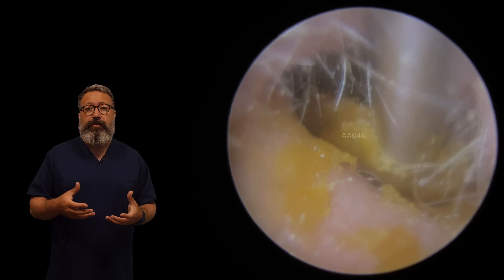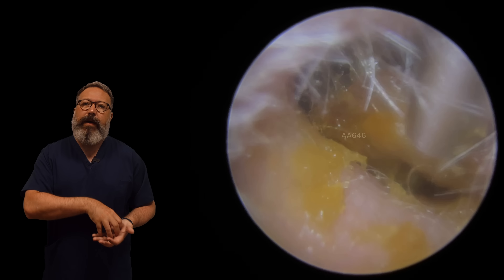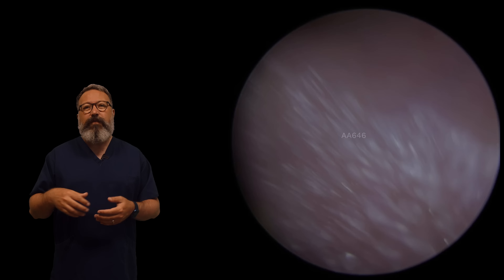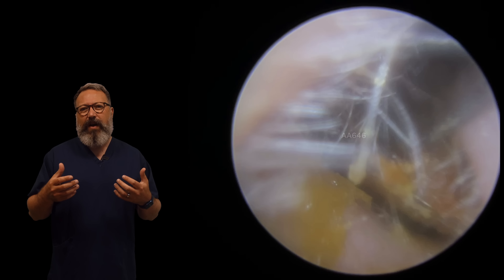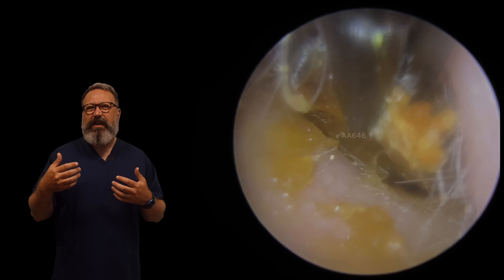Only because as you draw the wax over that front section, it's going to try and stick back to that little bit of wax at the front end. If we had a particularly hard piece of wax, then I probably wouldn't. I would say, well, let's just take it over the top and we'll tidy that bit up after.